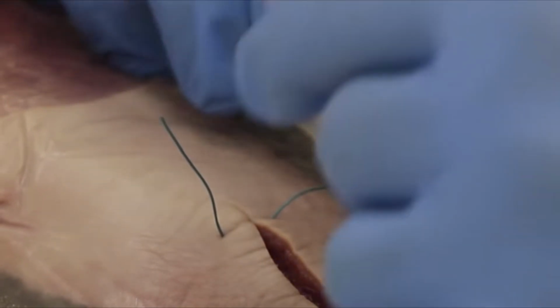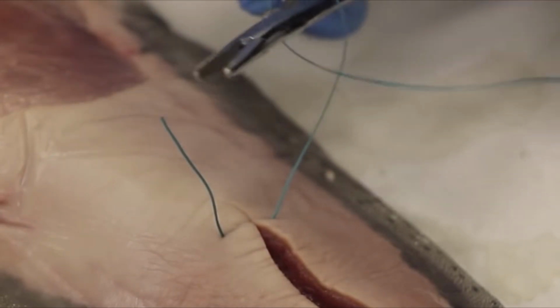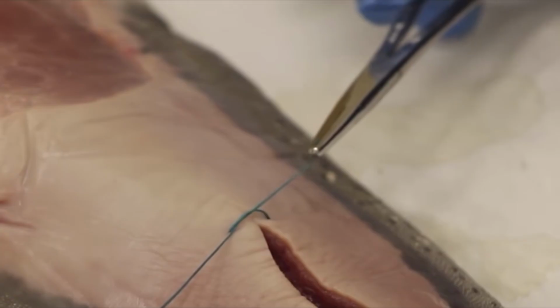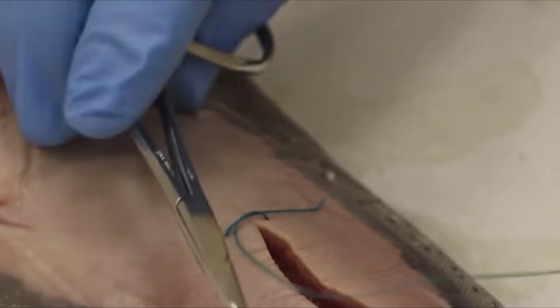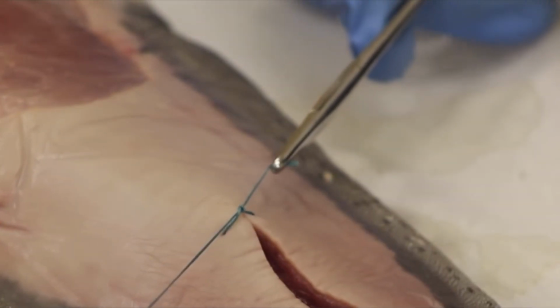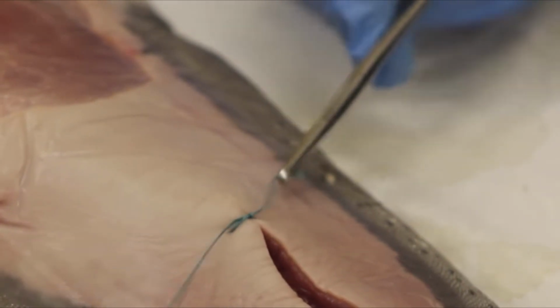The needle driver is placed between the two suture strands, but for a slip knot, wrap only once, not twice. Then grab the short end and pull in a single, consistent direction to advance the knot. Repeat the same motion and pull in the same direction. Keeping the same direction is what preserves the sliding behavior. Here is the key point.